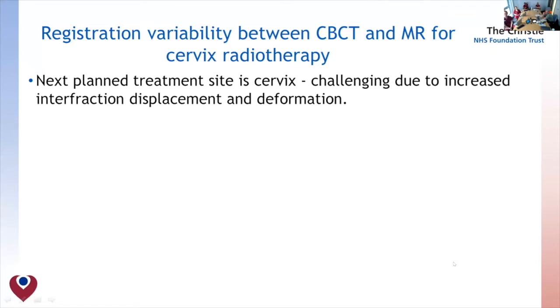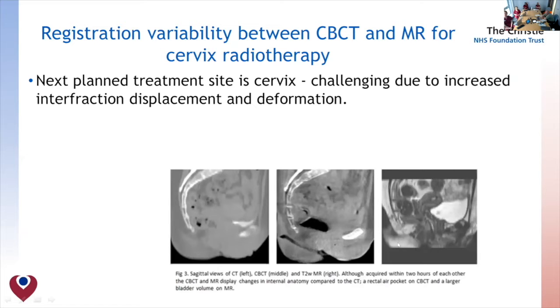Yeah, so our new treatment area will be the cervix. It's potentially a more challenging area for accurate target registration, and the rectal and bladder changes can lead to certainly changes in the target positioning and quite a challenging situation day to day.